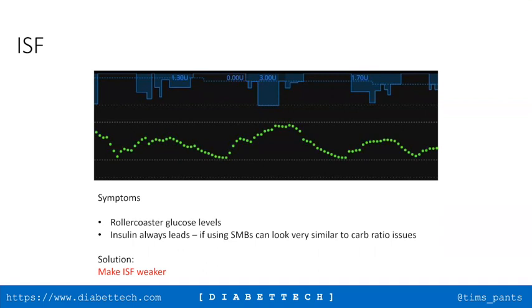And this leads me on to the DIA thing, because I also think that my DIA is too short. I've been using 5 hours because that was the default, and I made the assumption that the people that put Android APS together know more than I do. I just went with the default, and also the literature that comes with FIASP says 5 hours as well, approximately.